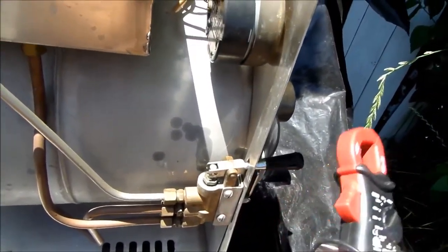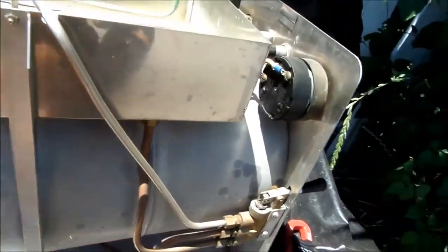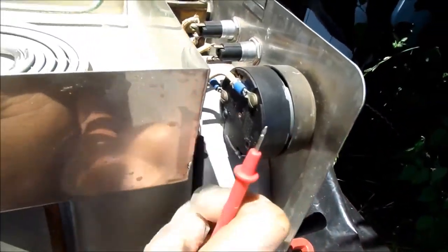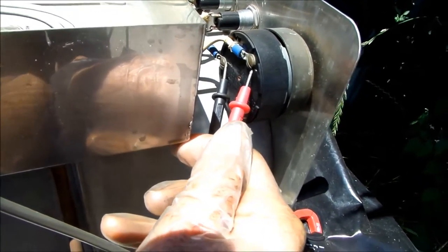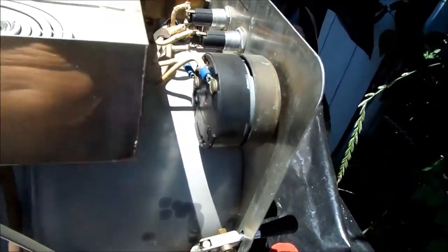The next thing we're going to check is the timer. Set the meter on continuity, turn the switch on, and see if we have continuity here. We do have continuity there, so we know that switch is good.